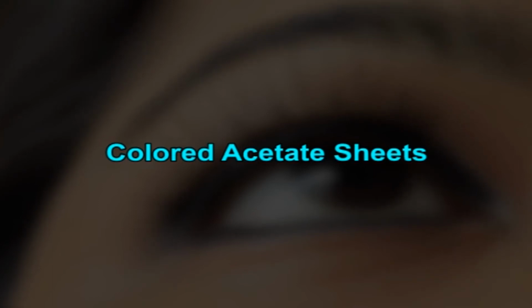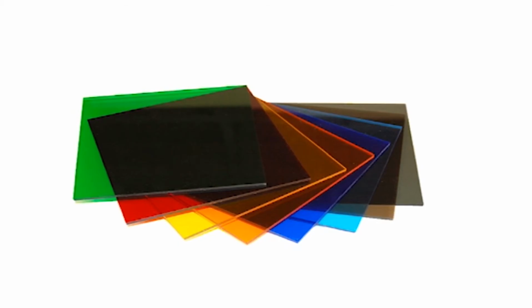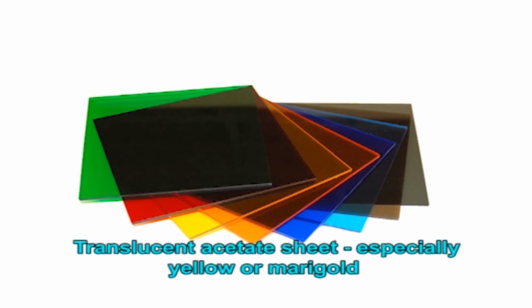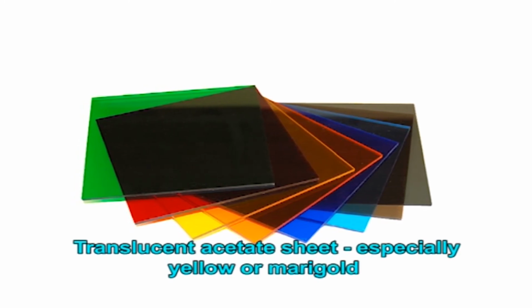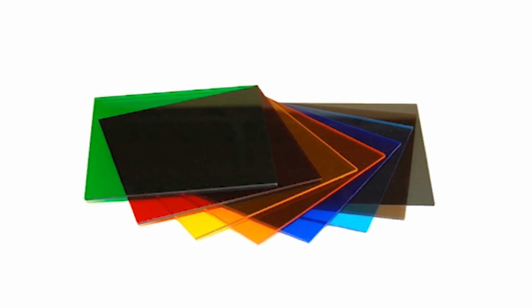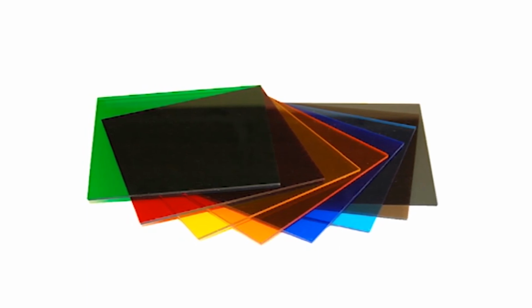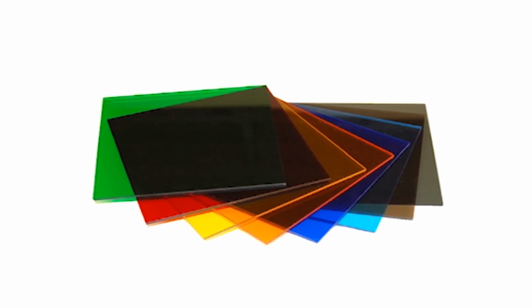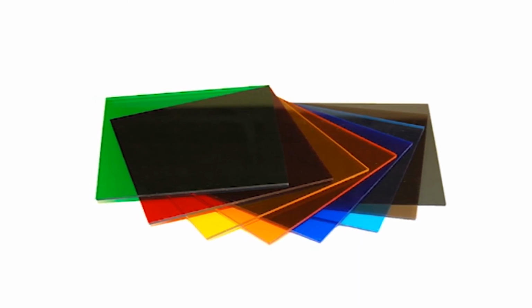Colored acetate sheets. When placed on the page, a translucent acetate sheet, especially yellow or marigold, can enhance contrast between the print and background, making words and letters appear darker and easier to read.